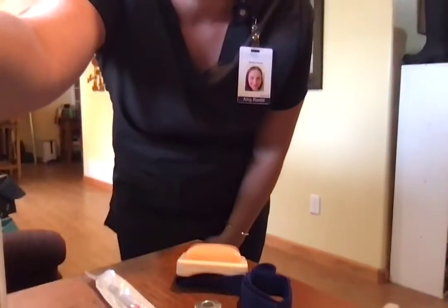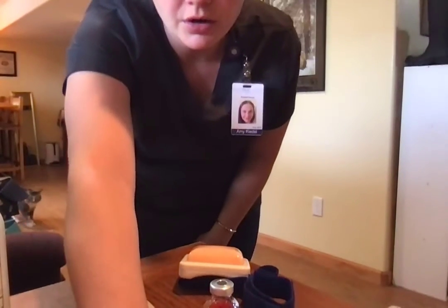So some side effects to watch for with tuberculin are rash, shortness of breath, dizziness. So we just want to make sure any anaphylaxis is not going to happen. And we're going to go ahead and prepare the needle here.